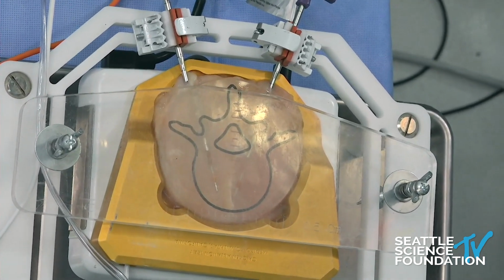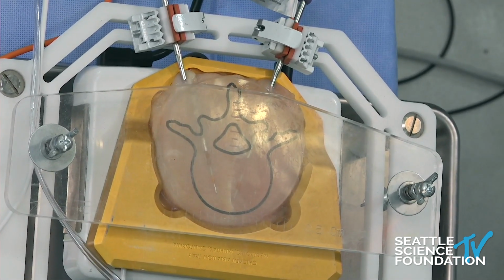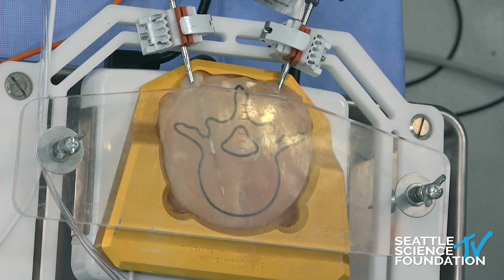And we'll start our next demo, and we will turn this on for however long it calculates that we need to burn. Typically, it's in the range of about 9 to 15 minutes, depending on the impedance, vertebral body size, the size of the probes, et cetera. So it's a little bit variable. Okay.